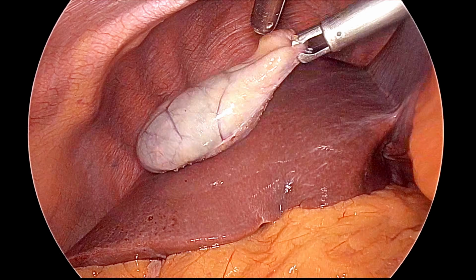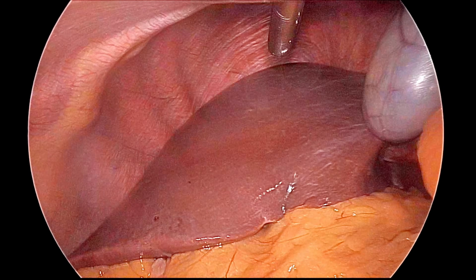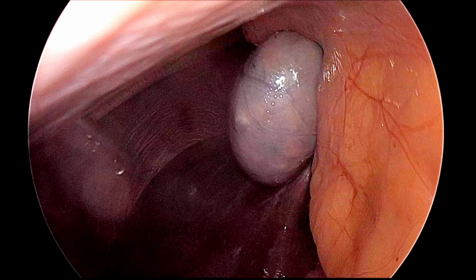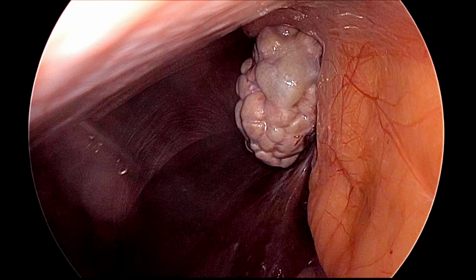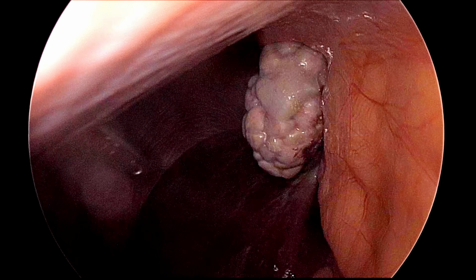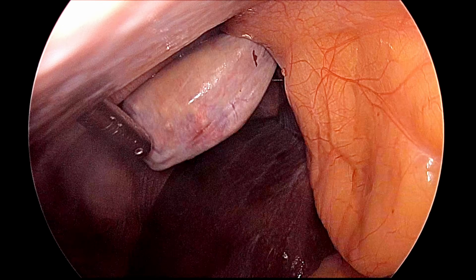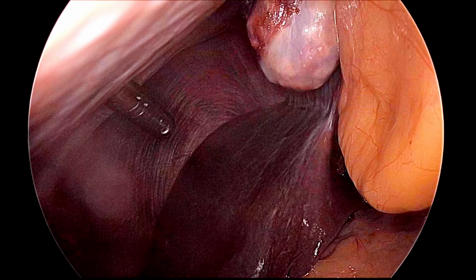After that the gallbladder neck will be taken into the cannula, and then the cannula also will be removed. Here we are using suction to suck the gallbladder, and we can see there are hundreds of stones in this patient. So what we should do first, we should take an ovum forceps, excise the neck of the gallbladder, and with the ovum forceps one by one we should evacuate all the stones and then only the gallbladder will come out. So this is the ovum forceps which is emptying the gallbladder.